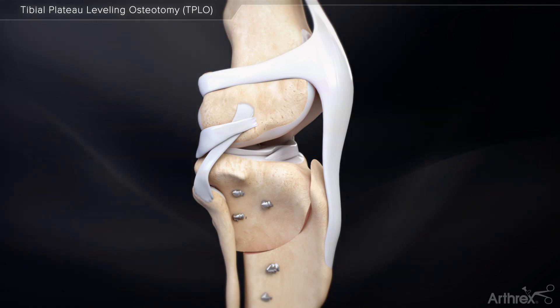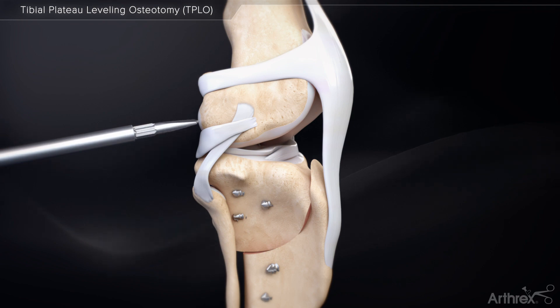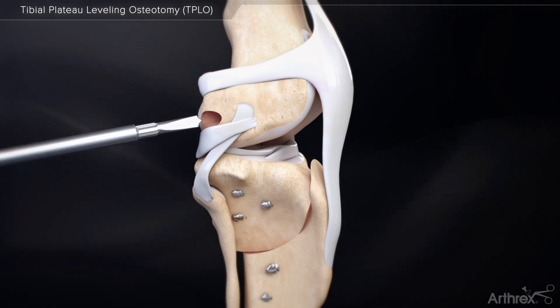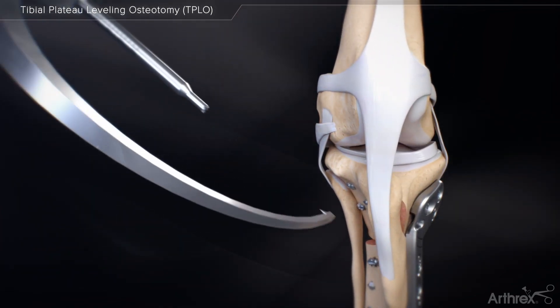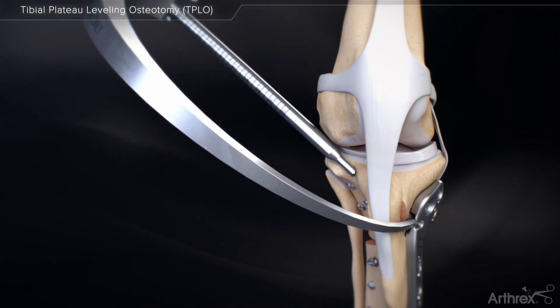To perform the internal brace ligament augmentation, expose the caudal aspect of the lateral femoral condyle. Drill a hole for the appropriate anchor using the appropriate size drill bit and guide. After exposing the tibial tunnel starting point behind the long digital extensor, LDE groove, place the tip of the aiming guide in the suture hole of the plate and push the drill guide sleeve down to the tibial surface.